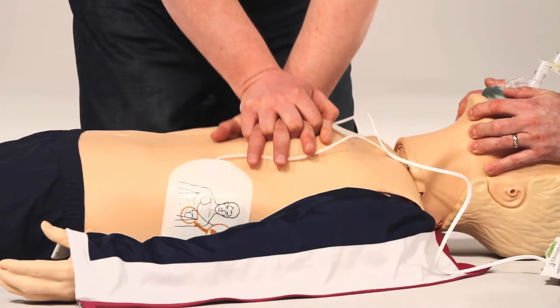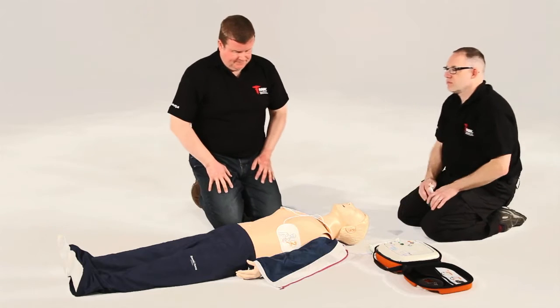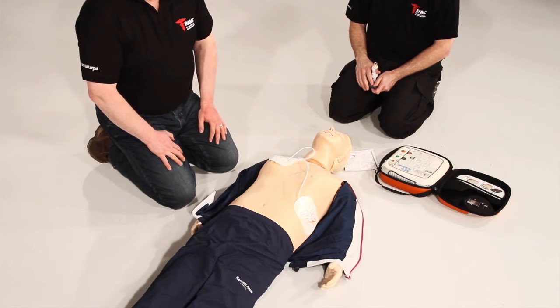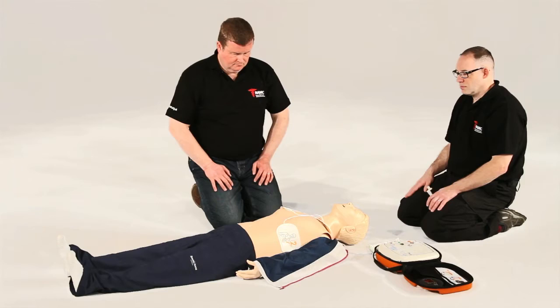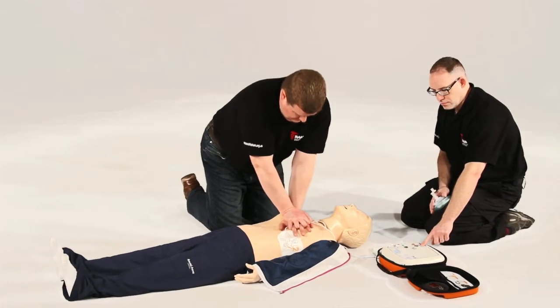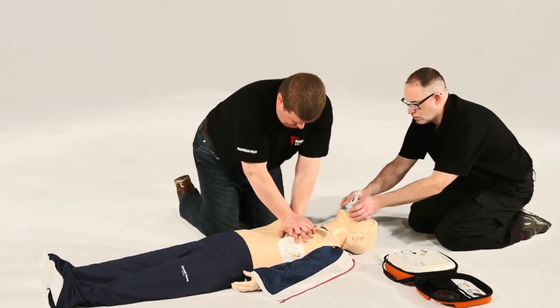Always continue CPR until either the patient wakes up or the AED prompts you to stop so it can reanalyse — this is usually every two minutes. At times, a patient's heart may not require a shock. In this instance, the AED will state: 'No shock advised — begin CPR now.' In these circumstances, it is impossible to accidentally administer a shock.